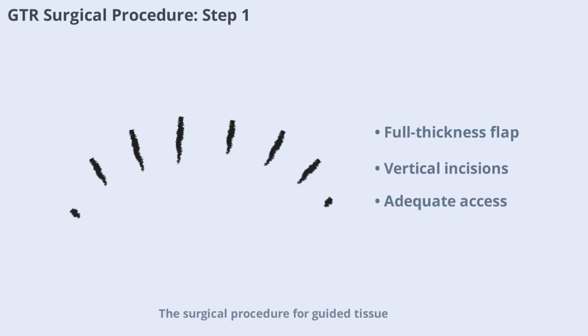The surgical procedure for guided tissue regeneration begins with raising a full-thickness flap.